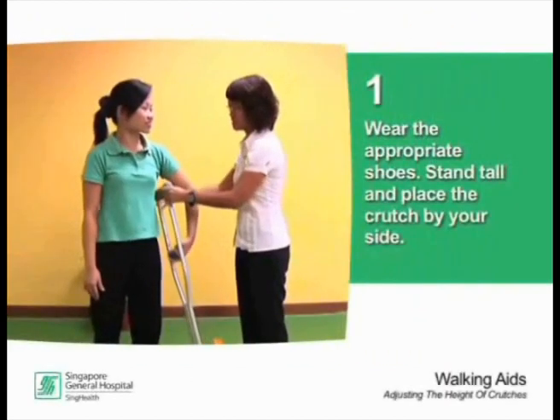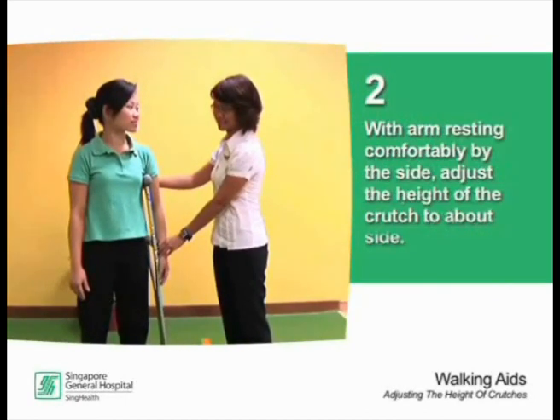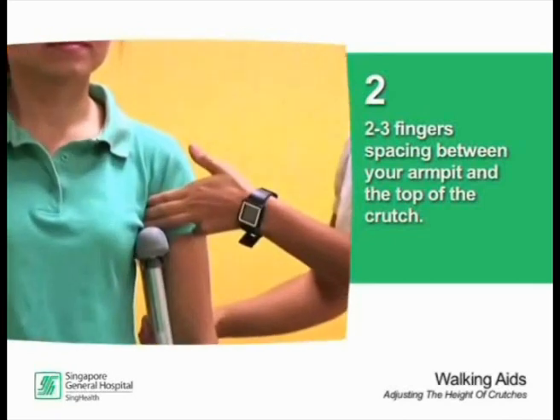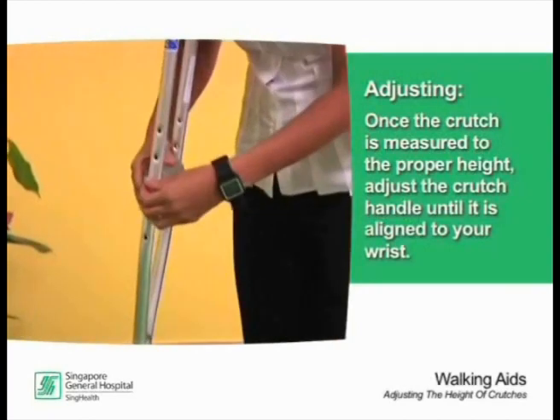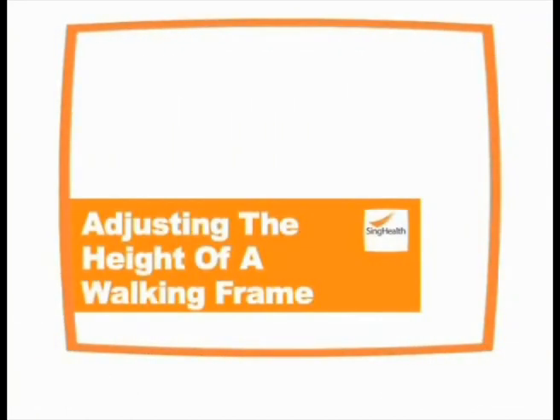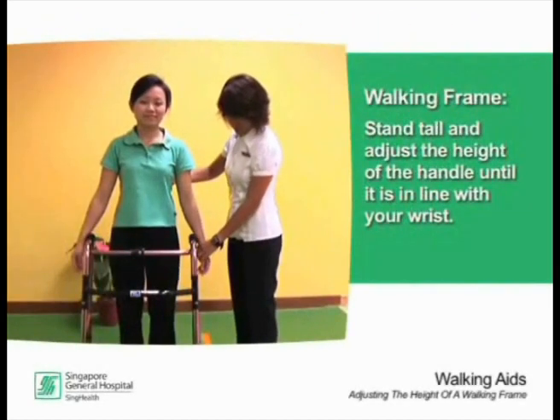For crutches, wear the appropriate shoes. Stand tall and place your crutch by your side. With your arm resting comfortably by the side, adjust the height of the crutch to about 2-3 fingers spacing between your armpit and the top of the crutch. Once the crutch is measured to the proper height, adjust the crutch handle until it is aligned to your wrist.